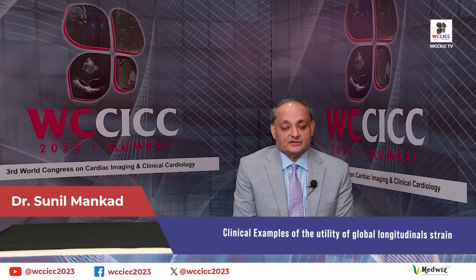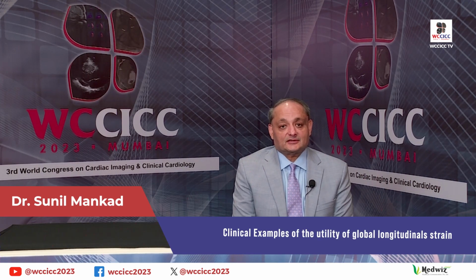Today I'm going to give a lecture on strain imaging and practical applications. We review the importance of strain imaging, which can detect subclinical left ventricular dysfunction. We then look and see where it can be used.